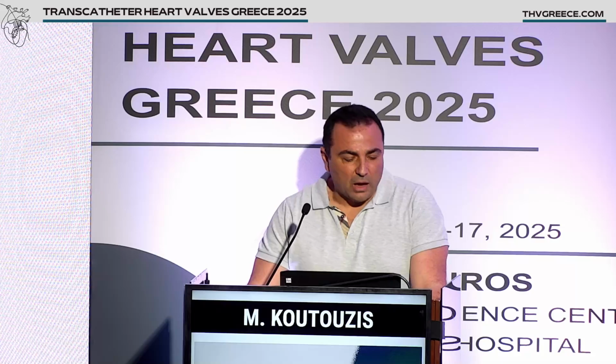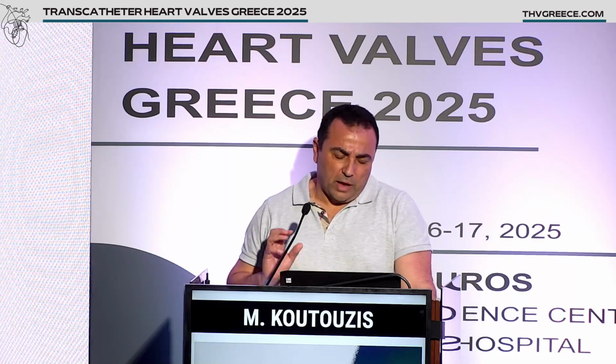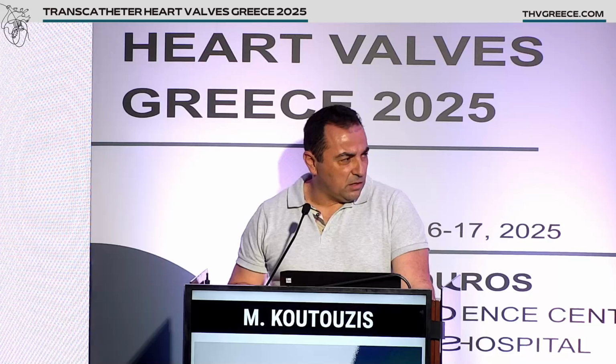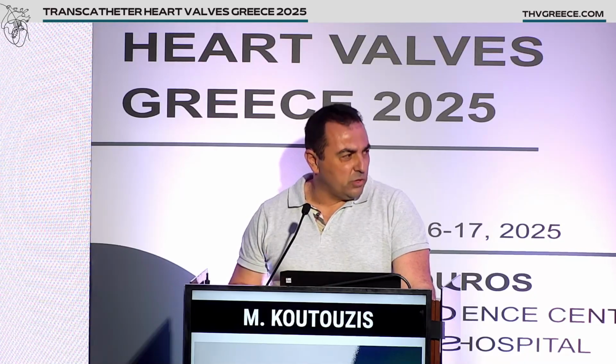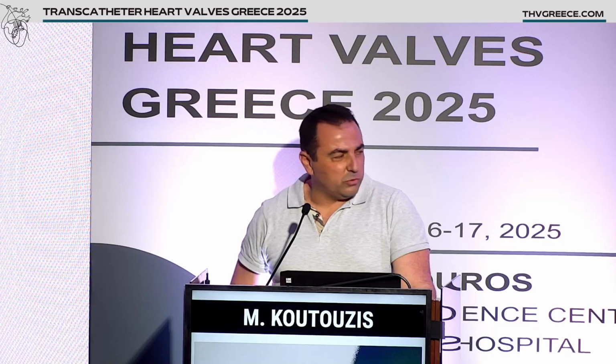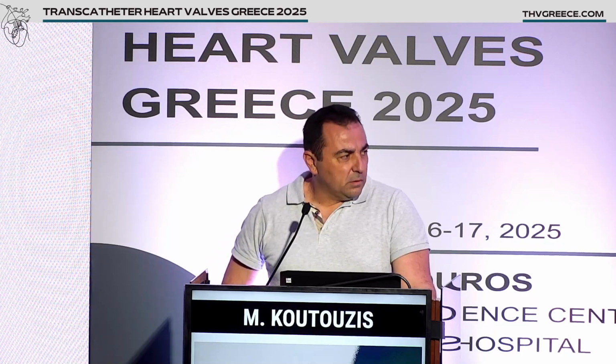And second, can I ask you, the e-sheath went in easily. Did the valve through the e-sheath, when expanded, also go in easily, or did you have to push? Yes, it was very easy. So it was very adequate. My plan was to dilate also in the sheath, but I went through the lesion so easily that I said, okay, I will try it this way, and it was a straightforward case. Because sheath and valve are 2 different things. A comment? Yes. That was also my question.